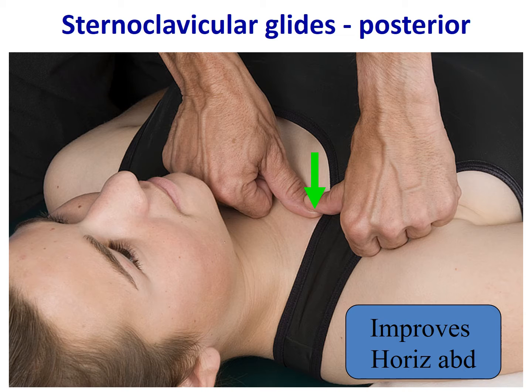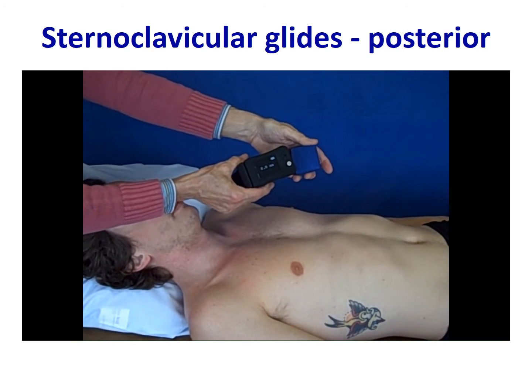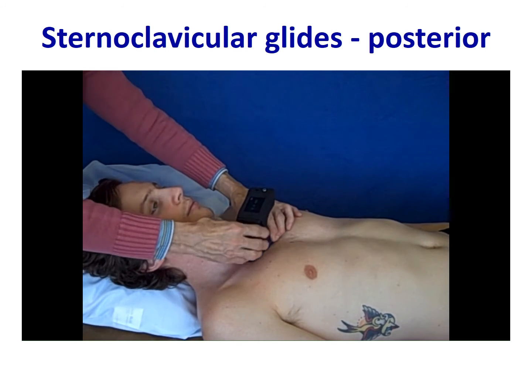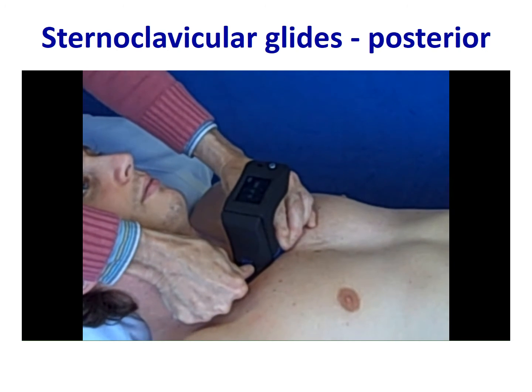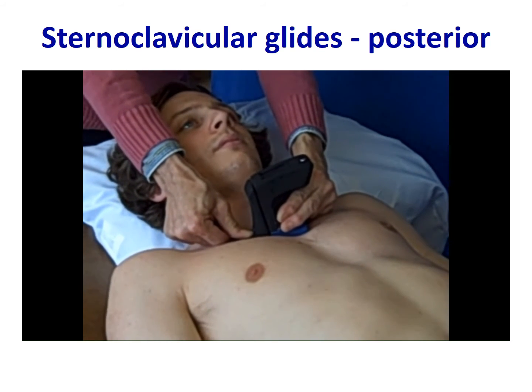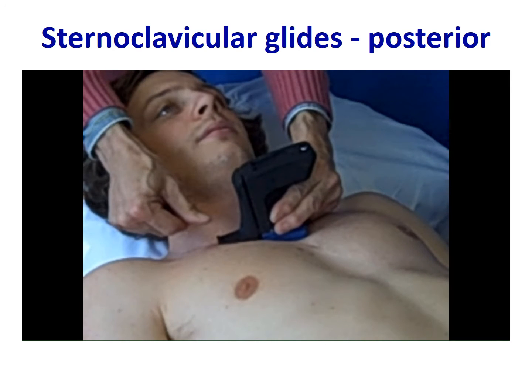In addition, you can perform sternoclavicular glides. A posterior glide can be used to improve horizontal abduction. This usually involves a thumb-over-thumb technique when done manually, allowing what's known as a dummy thumb to move the proximal clavicle on the sternum. Here you see the Mobilator being used to perform this technique as well. The device is placed over the proximal clavicle, and posterior mobilization techniques are applied to facilitate horizontal abduction.